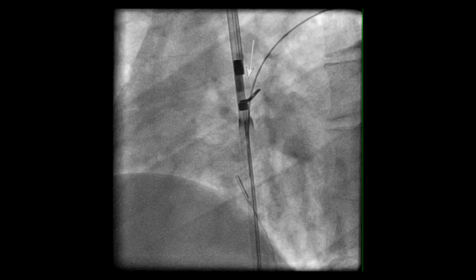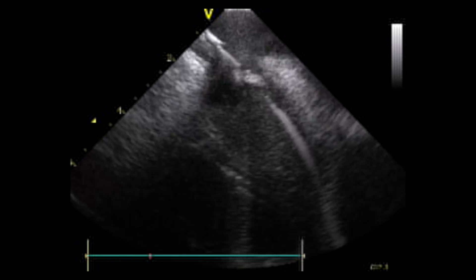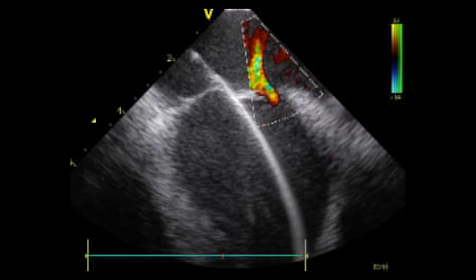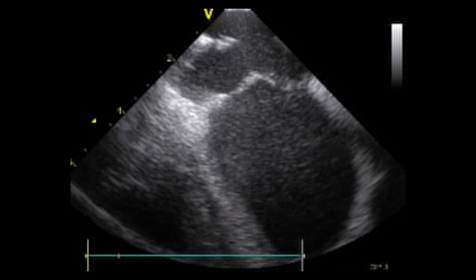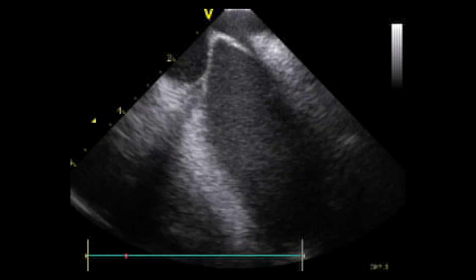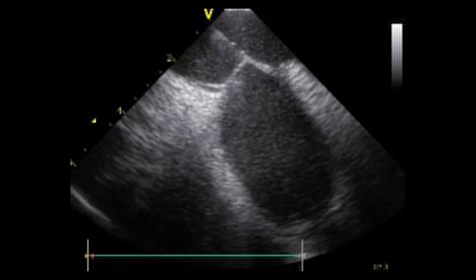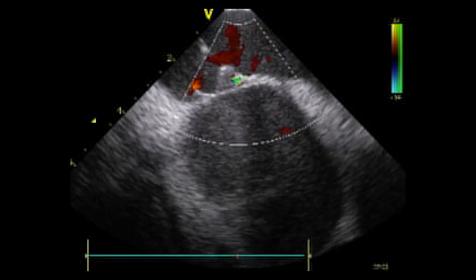The Noble Stitch EL is then advanced into the superior vena cava with the arm carrying the suture into the atrial septal defect. As viewed here on ultrasound and fluoroscopic imaging, the needle can then be deployed to capture the suture and pull it through the rim of the septal defect. The primary catheter is then advanced through the septal defect into the left atrium and drawn proximally until it comes in contact with the lower rim. Applying additional tension allows us to set the bite size of the needle as it fires through and picks up the suture, pulling it through the lower rim of the atrial septal defect, which effectively repairs the atrial septal aneurysm as shown here.